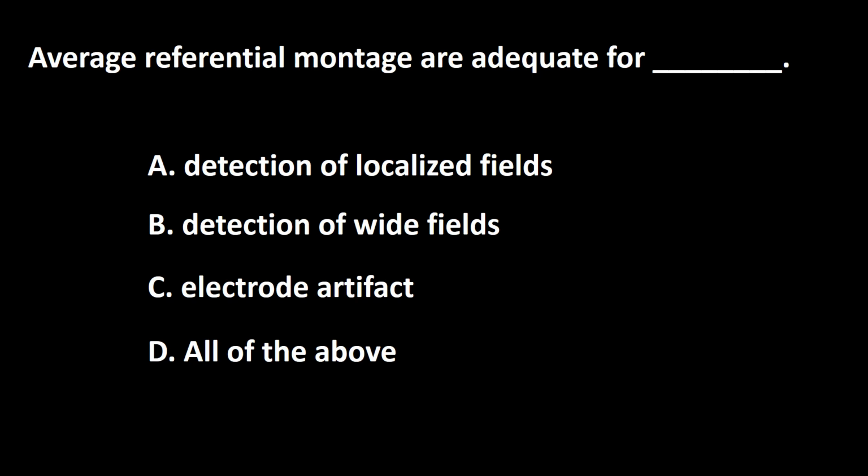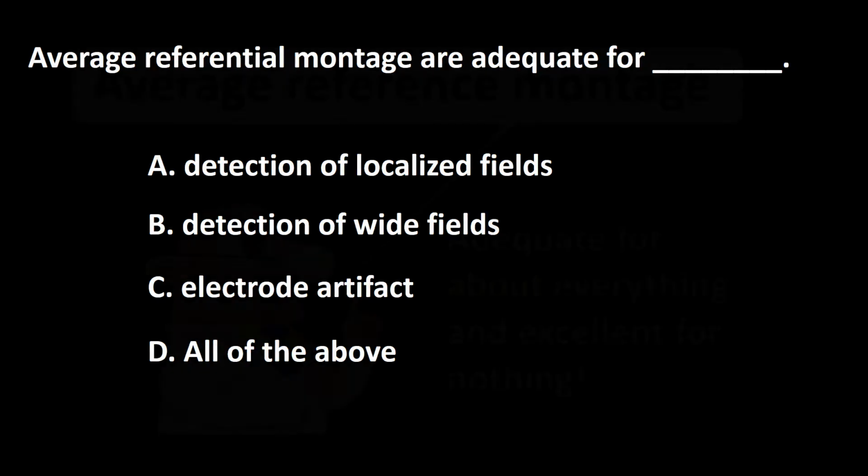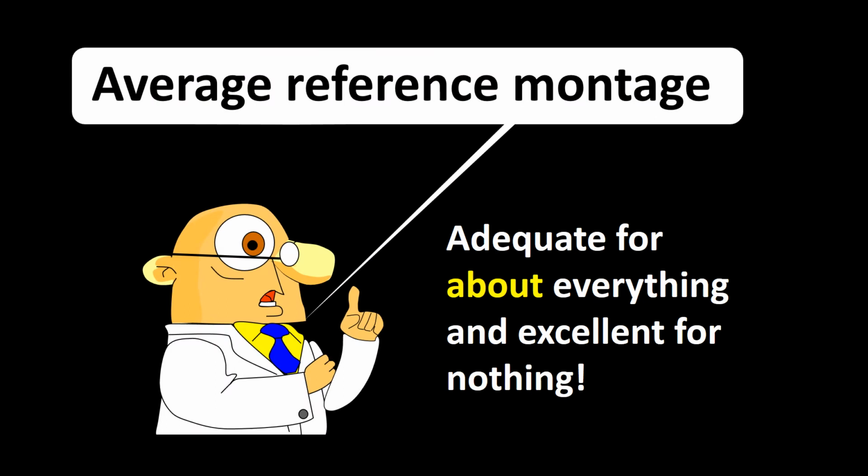Detection of localized fields, B. Detection of wide fields, C. Electrode artifacts, D. All of the above. We could say about average reference montage that they are adequate for about everything, but excellent for nothing.